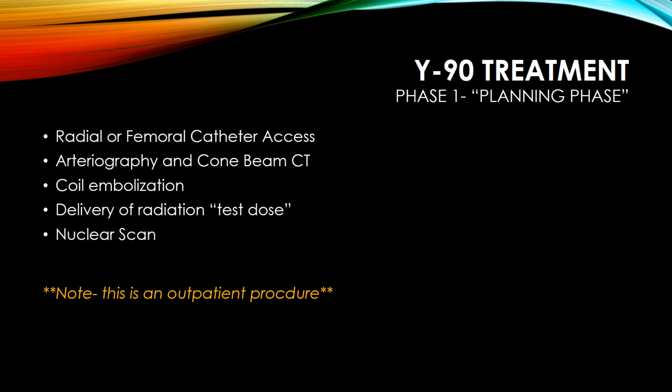The purpose there is to make sure that we don't see excessive hepatopulmonary shunting or reflux into arteries that supply the gastroduodenal regions, because if these things happen, then we look at serious morbid complications like radiation pneumonitis and gastric ulceration. And this is an outpatient procedure.